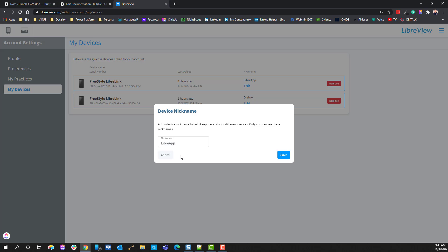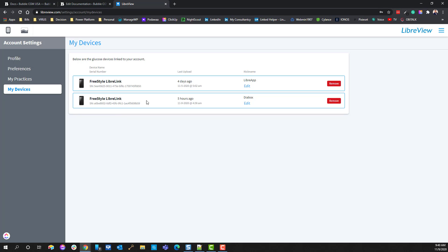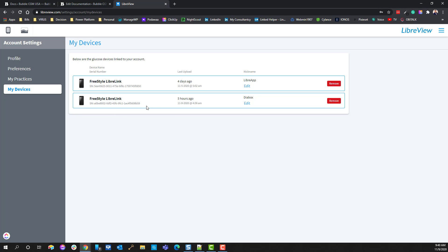So before you go ahead and add Diabox, the integration, you may want to go ahead and give the nickname LibreApp to the only item that would be connected. And then after you've connected your Diabox app, you'll want to go ahead and name it as Diabox. You don't have to necessarily do that, but anyway then.